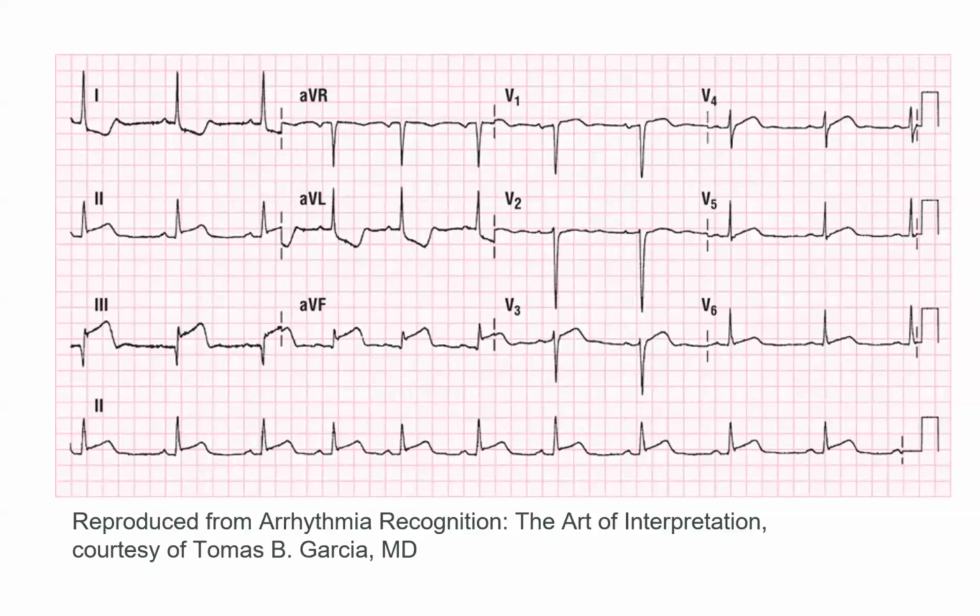So this is something we haven't really talked about. Okay, we're here, we're on scene, everyone on scene. Hey, Mr. Smith, my name's Nick, this is my partner, Nate. We're gonna check some quick vital signs. Nate's gonna get you hooked up. Are you allergic to aspirin? Because you're having some crushing chest pain, right? Let him tell you the story, don't give him the words. Crushing chest pain, okay. Hey, are you allergic to aspirin? No. Go ahead. I'm talking about the first 3 or 4 minutes on scene.